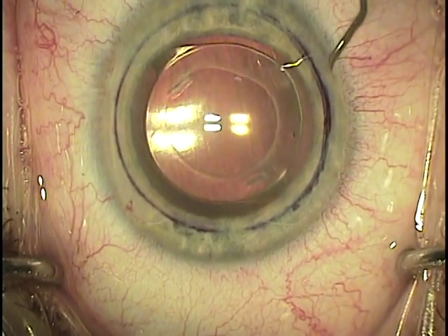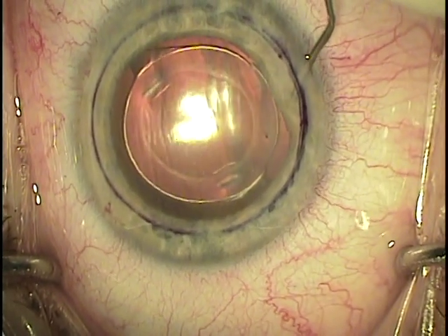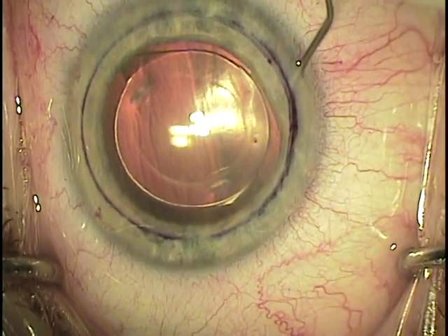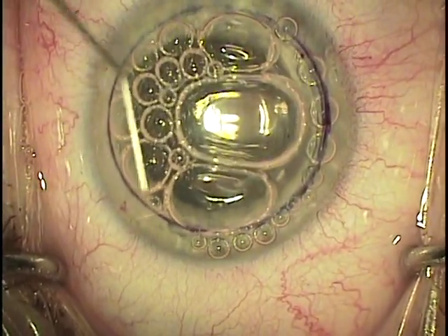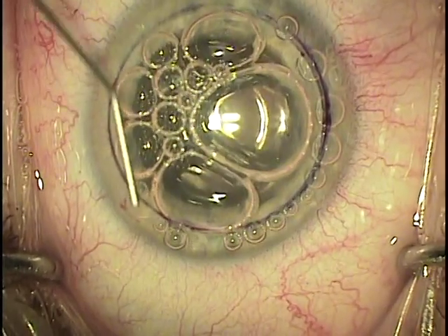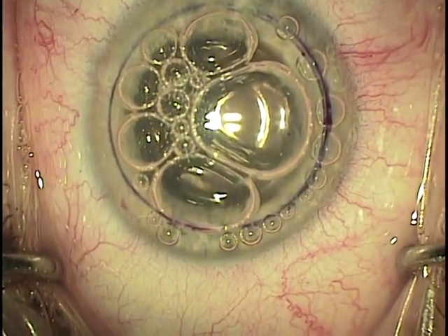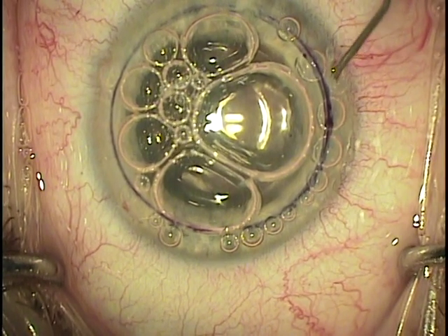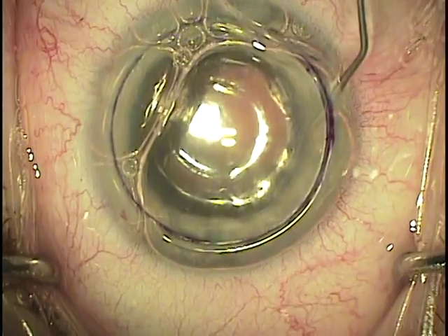An air bubble is introduced under the donor tissue and if there's any movement of the donor at that point I can reposition by further limbal blotting or go through one of the stab incisions with the cannula and rotate the donor into proper position. Once proper centration is achieved, a full anterior chamber bubble is inserted and stroking the surface helps remove any interface fluid.